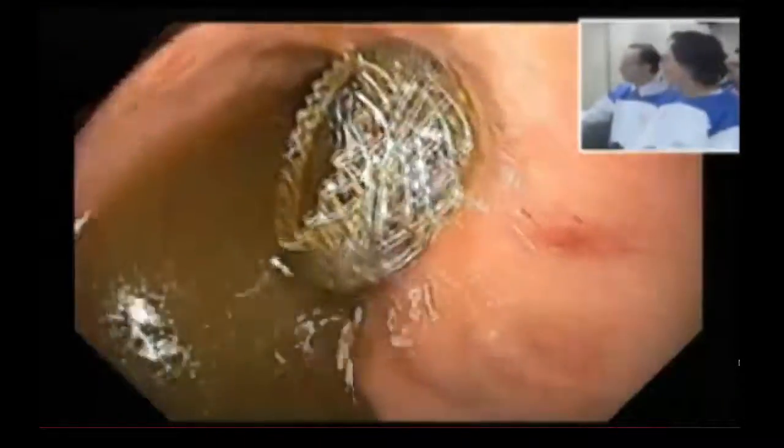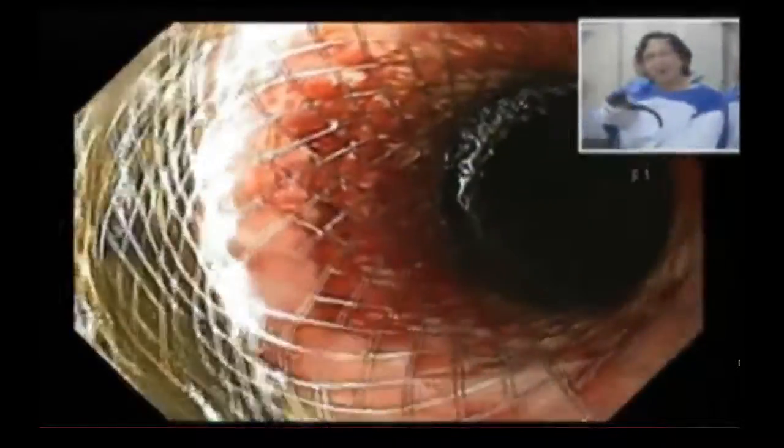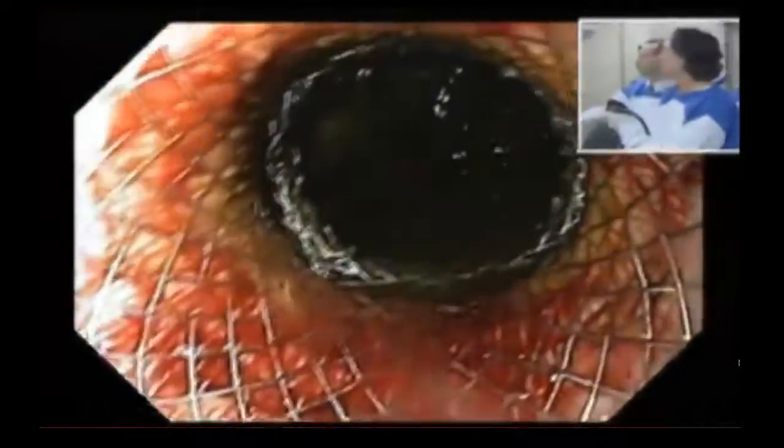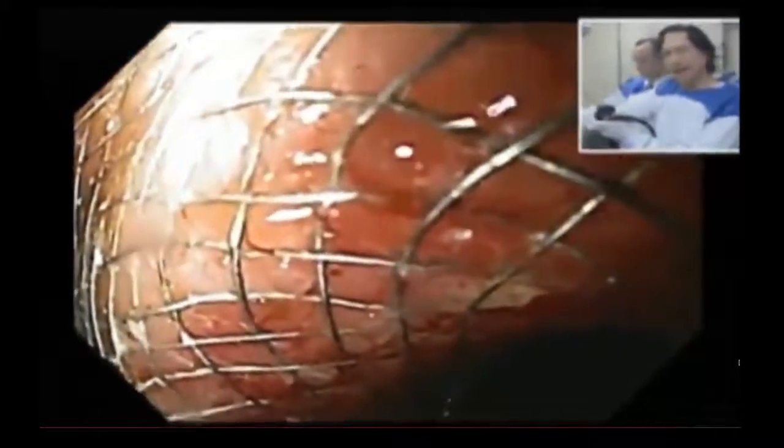Ken, when you push the endoscope through into the cyst, is there a risk to move this stent because you just put it? No, very little, because the flanges are holding the walls together. So of course you have to go cautiously if you have friction. So you want to dilate to a diameter greater than the diameter of your scope.